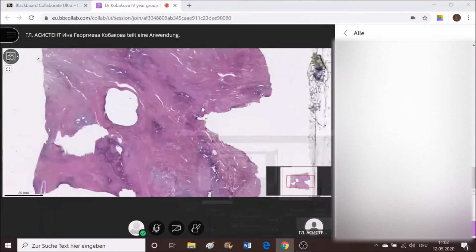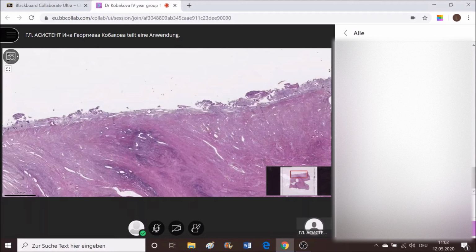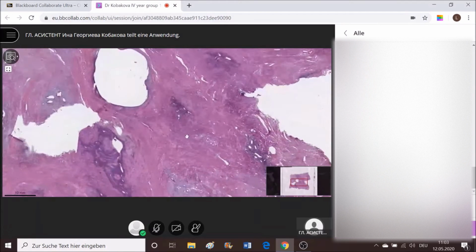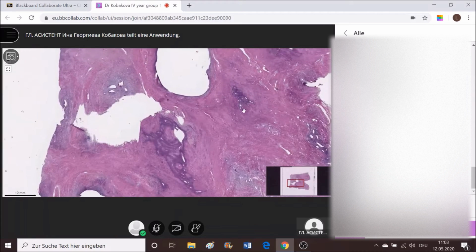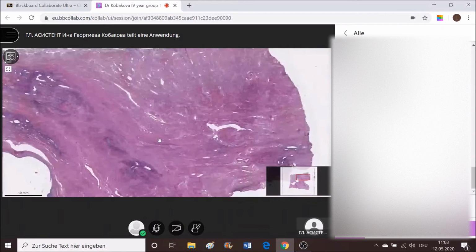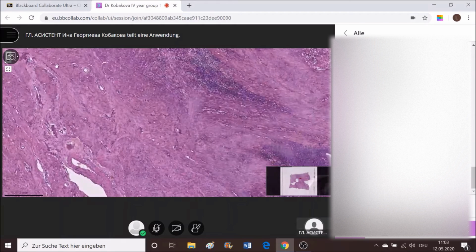So what we observe here is a superficially taken layer of uterine glands here at the periphery of the slides. Further, it's a little bit hyperstained. Don't pay attention to this. What we should have in mind is the idea of presence of glandular structures in between smooth muscle cells. So these here are smooth muscle cells, which are very well observable.